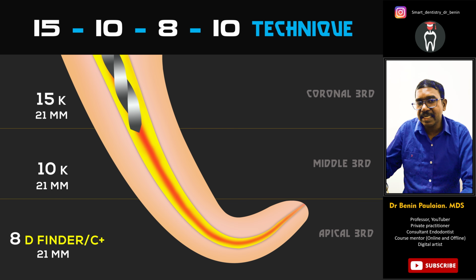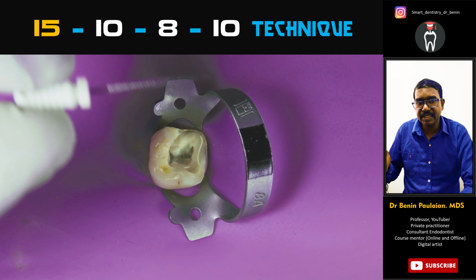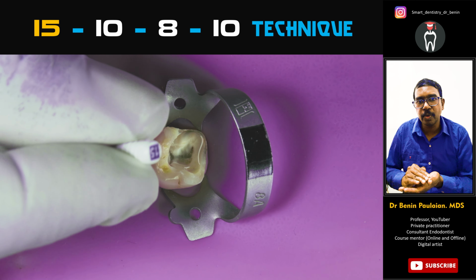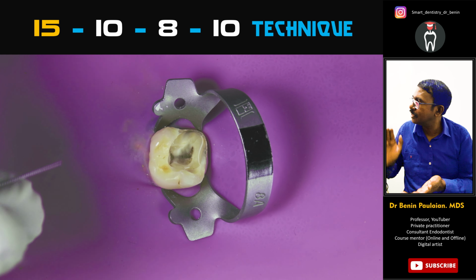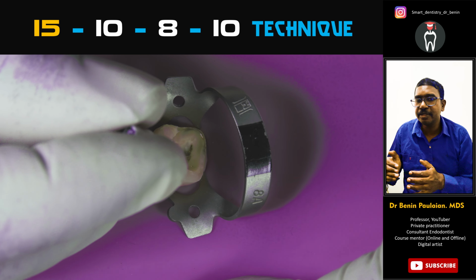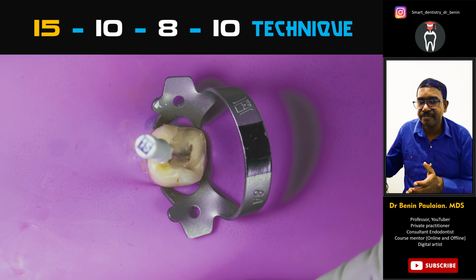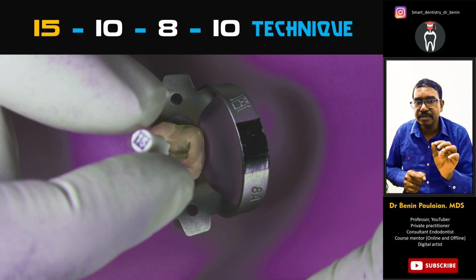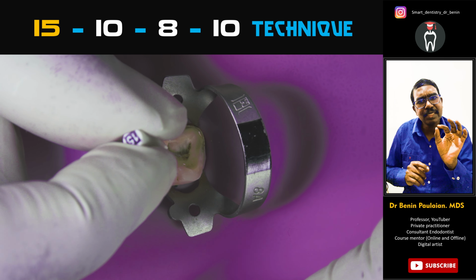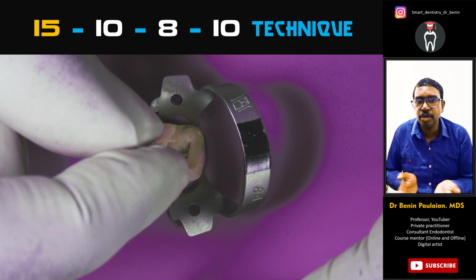So the coronal 1/3, we have to negotiate with a 15 size K file. So take a 15 size K file and try to negotiate the coronal 1/3 of all the 4 canals. In this model, there are 4 canals: the mesiobuccal, mesiolingual, distobuccal, and distolingual. You can see that I am using a 15 size file and I will be using a clockwise, counterclockwise rotation to a minimal amount, maybe 30 degrees to 60 degrees, nothing more than that.